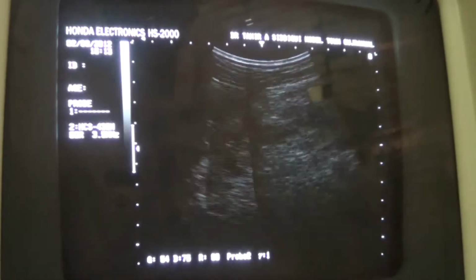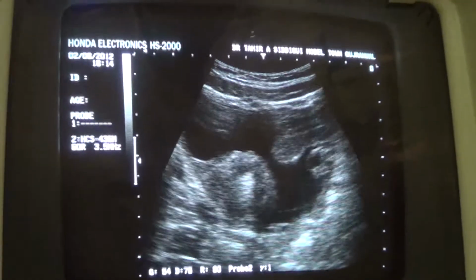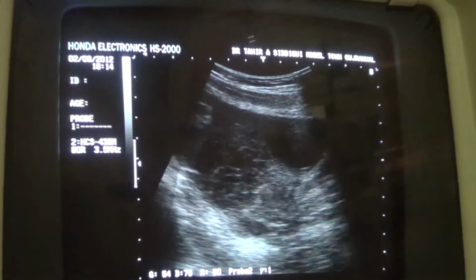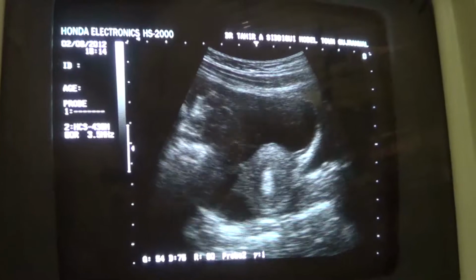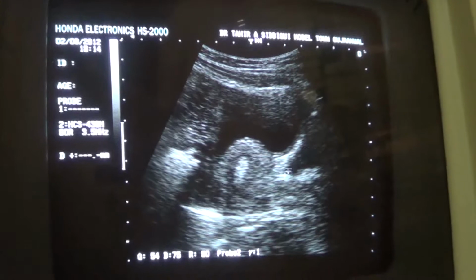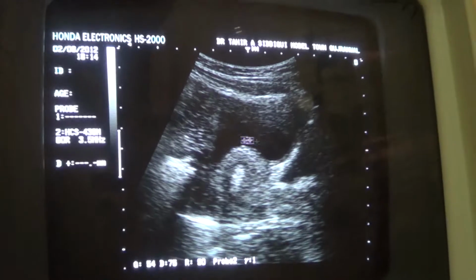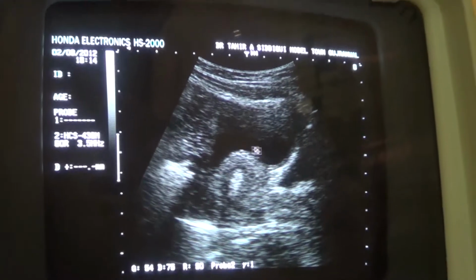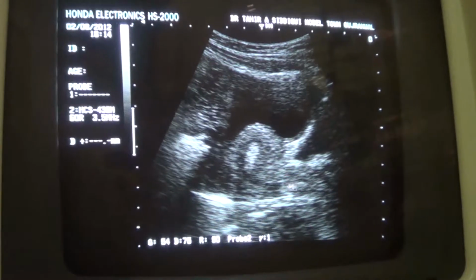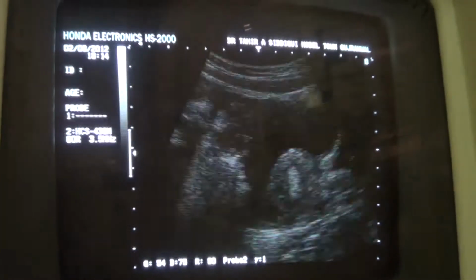Now in the pelvic region, this is the longitudinal section that shows the partially filled urinary bladder. This is the urinary bladder, partially filled. This is the uterus as seen through the ascitic fluid. Now through the fluid you can see that the uterine myometrium is normal, the endometrial canal is in secretory phase. This is the cervix. So these areas are normal, no focal lesions seen.